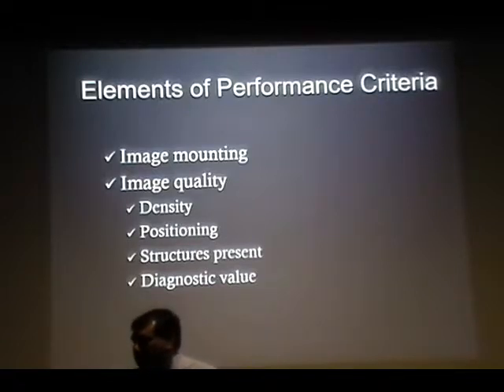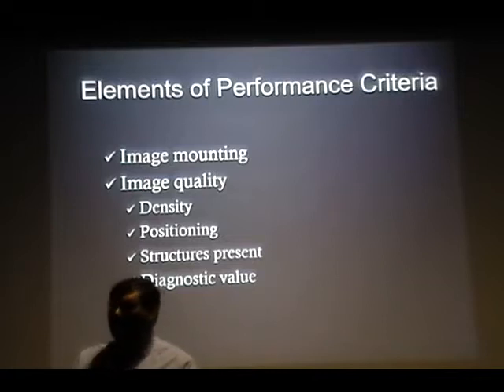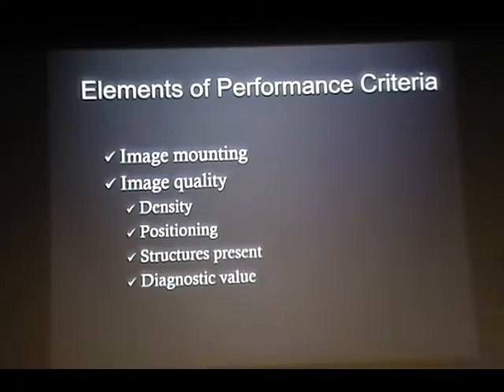And all that I follow, but is density the pixels per square inch? Yes, we'll go into the details. For now, density is, can you see clearly or not? We'll go into the details when I talk a little bit about digital dentistry, because if I talk a little more, I'll lose other students. And is it of diagnostic value or not?